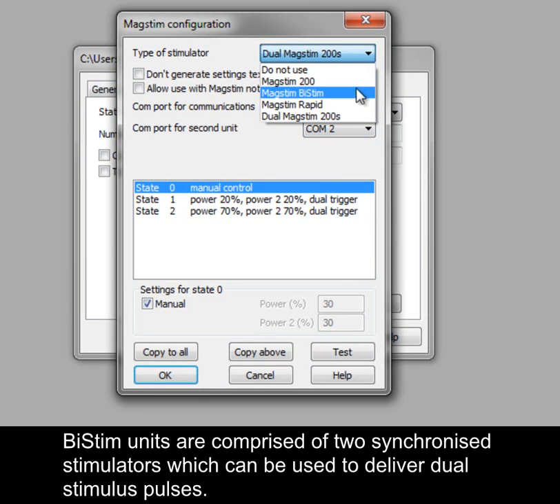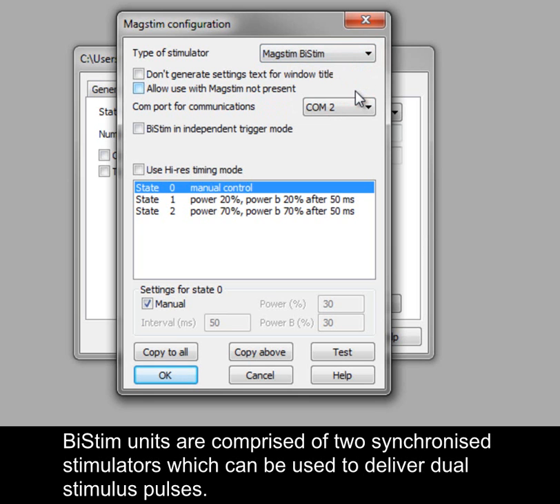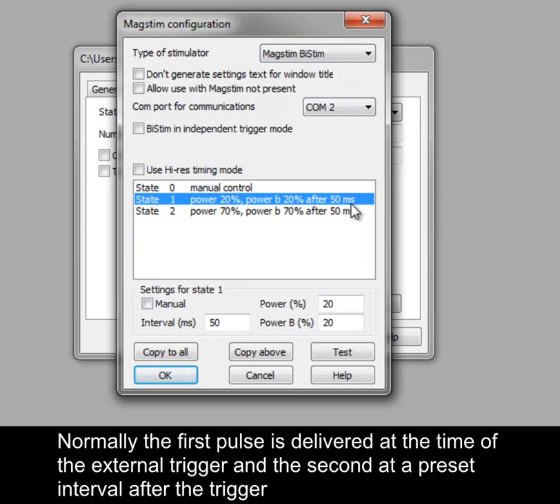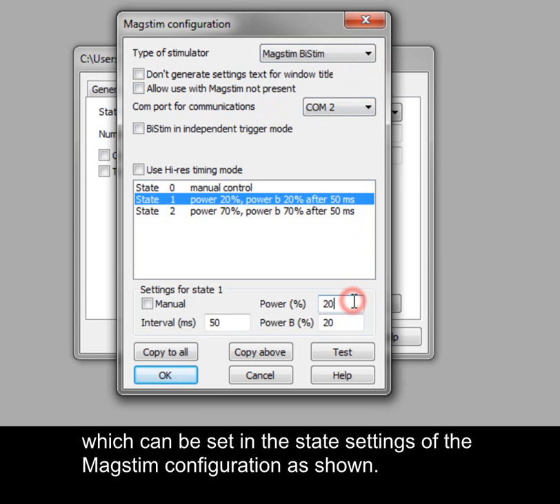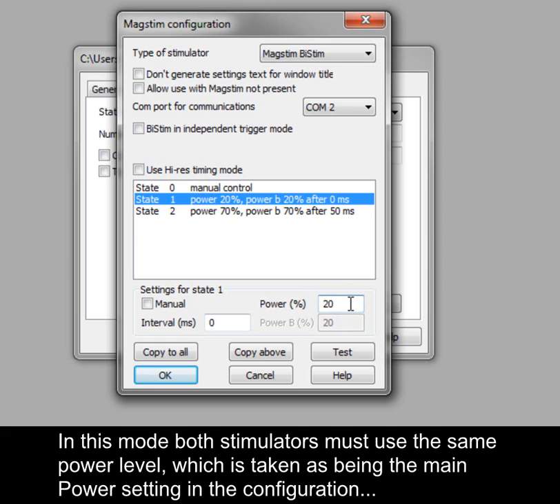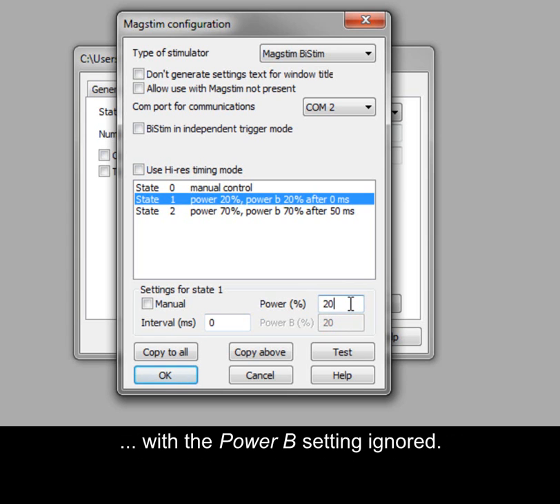BiStim units are comprised of two synchronised stimulators which can be used to deliver dual stimulus pulses. Normally, the first pulse is delivered at the time of the external trigger and the second at a preset interval after the trigger, which can be set in the state settings of the MagStim configuration. Setting an interval of 0 switches the BiStim into simultaneous pulse mode, in which both stimulators must use the same power level, taken as the main power setting in the configuration, with the Power B setting ignored.